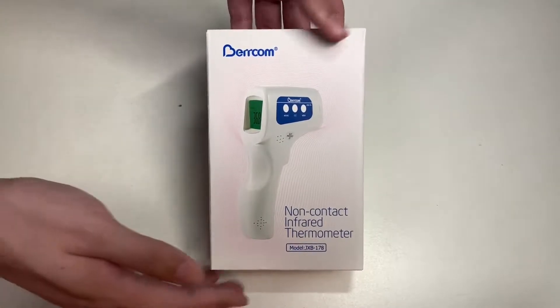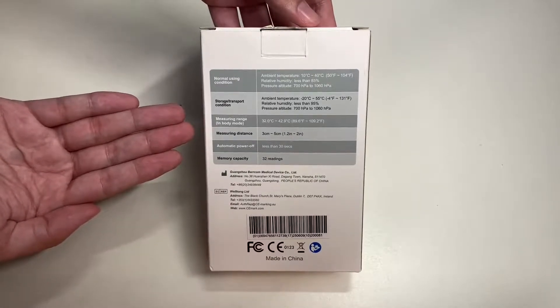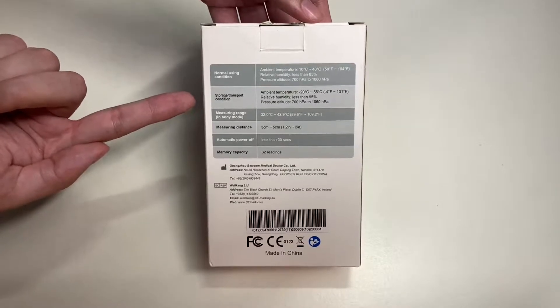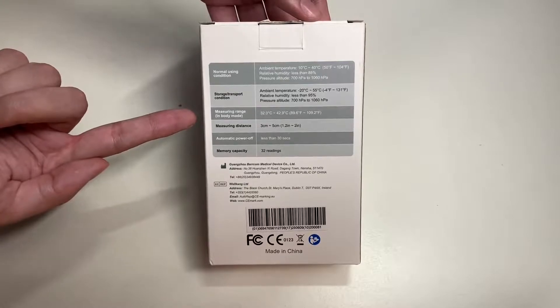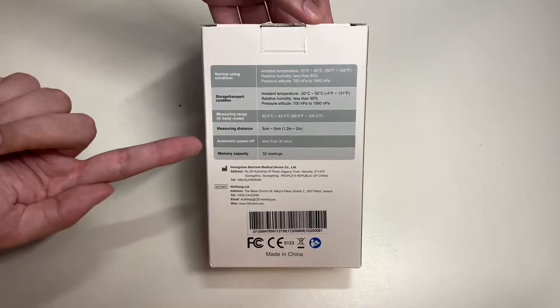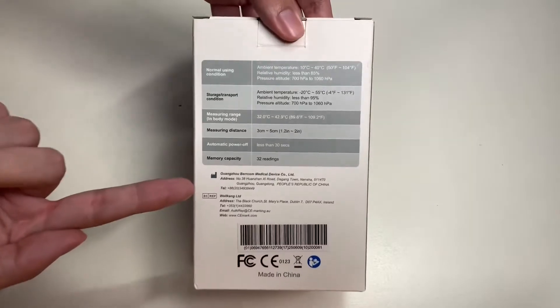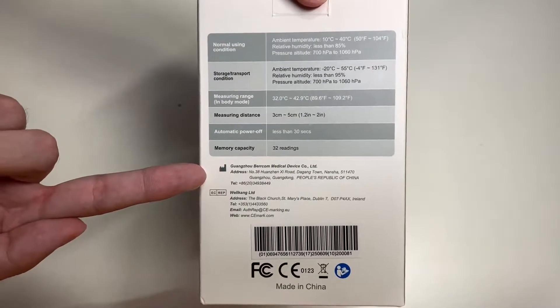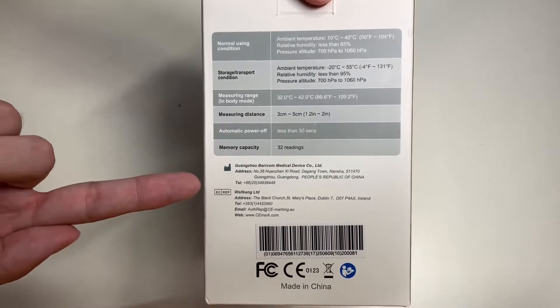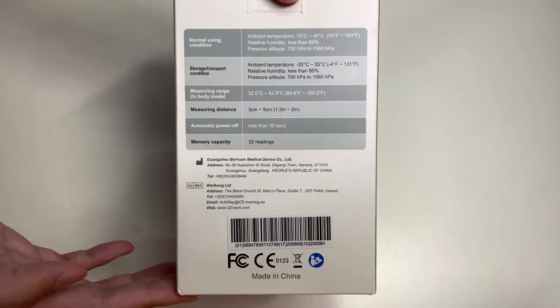Let's take a look at the back side of the box, which talks about the specifications of this infrared thermometer. Here you have the normal using condition, storage, transport condition, measuring range in body mode, and measuring distance. It has automatic power off and a memory capacity of up to 32 readings. Here's the manufacturer and all the other information — you can pause the video to look this up carefully.